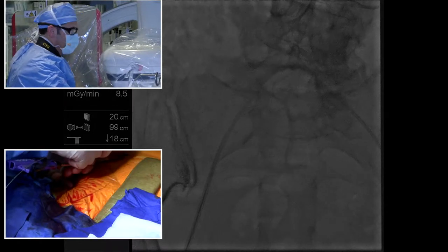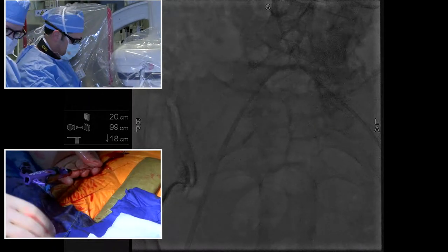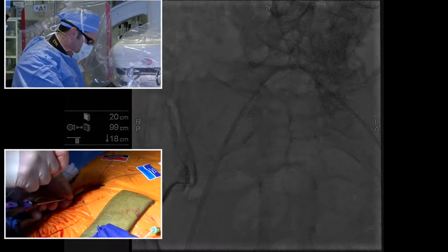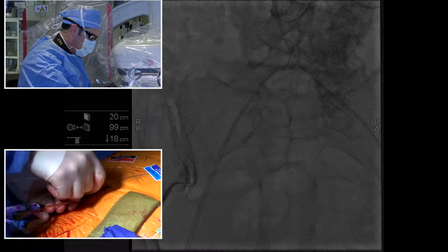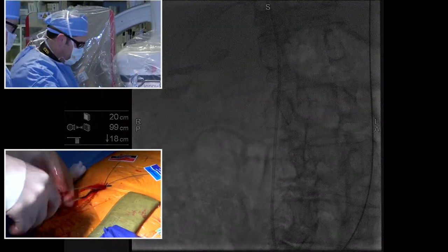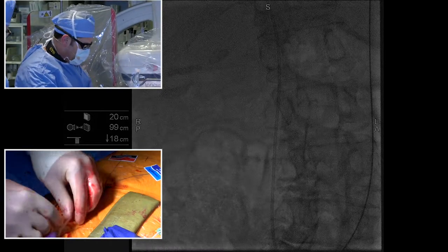Another fine Abbott Vascular product. Okay, can I take this out? Can I have a regular J, please? So the stiff wire sometimes will not come through the device because of the way it's designed. Not sure why, but it gets stuck. Never figured that one out. It happens about 1 in 100. Okay. Especially when we're live. Always. Can we walk this out?